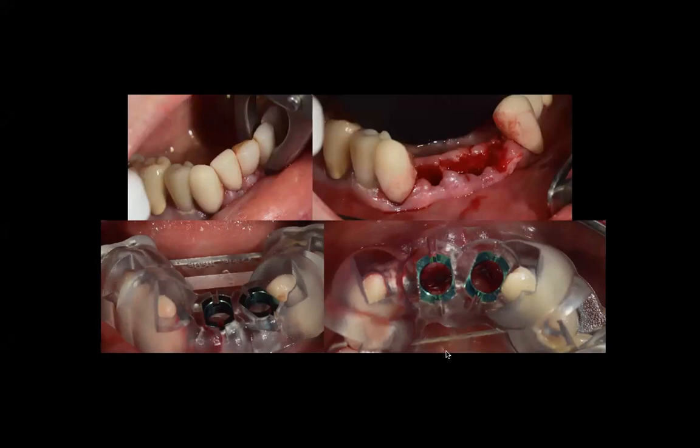That means if there is any gap between the guide and the tooth, if you can get your explorer in there, that means the guide is not sitting in all the way. Something is holding that guide back. Okay? So before you make any osteotomy, stop for a minute and take a look, and you may need to make an adjustment.